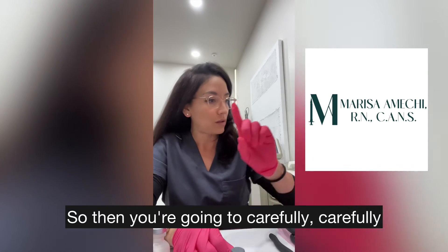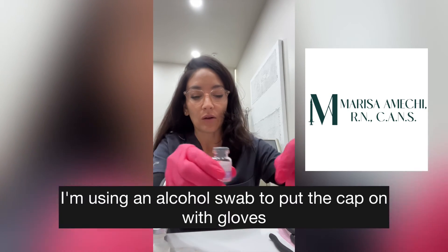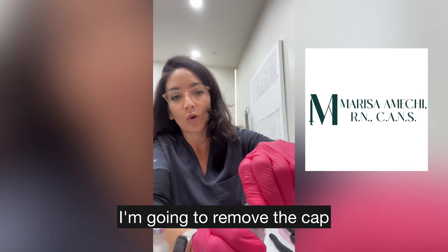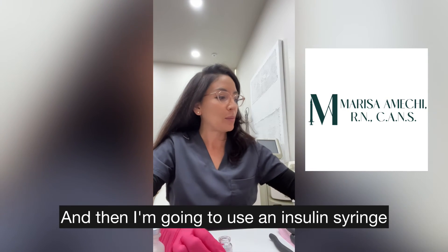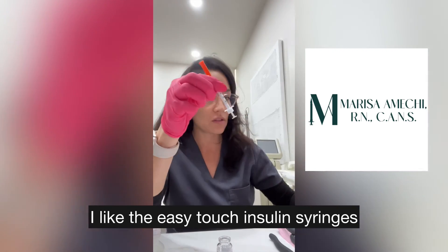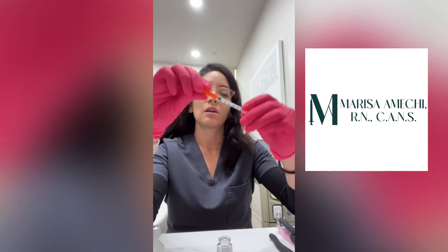Then you're going to carefully take off the rubber cap. I'm using an alcohol swab to handle the cap. With gloves on, I'm going to remove the cap and place it on its head.